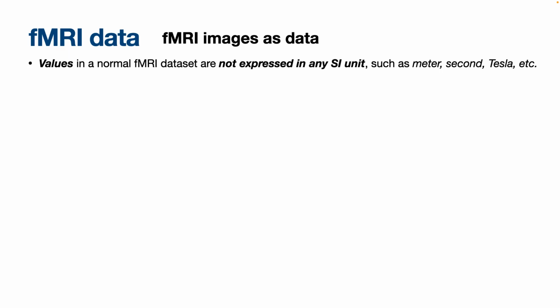Same goes with temperature. All of these units that we use in science, they are fixed, and then that means that we can actually compare them across experiments. No such thing in most MRI measurements. We can be very careful about our MRI measurements and then actually produce things that are calibrated in this way, but the standard fMRI images that we get are unitless. They are just numbers. And you can imagine that you don't have any firm footing anymore when you have only numbers, right? How are you going to relate from scanner to scanner? Well, you can't.